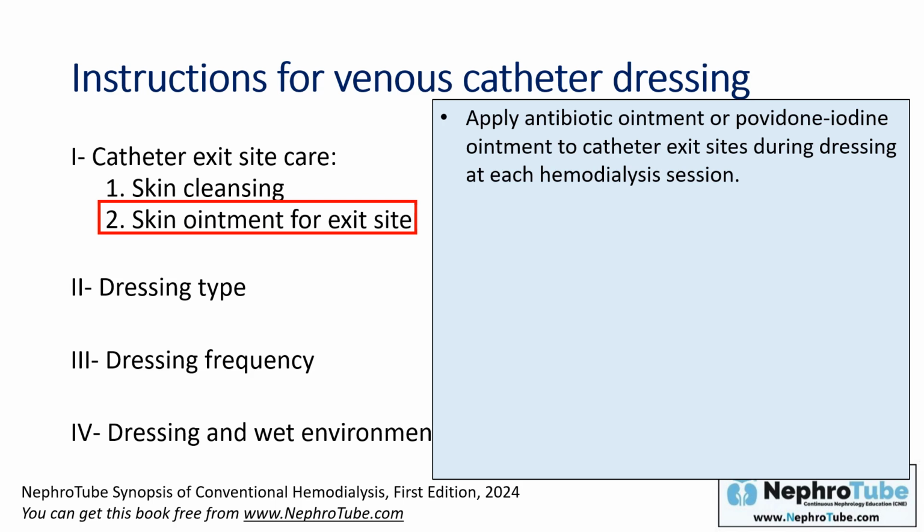I mentioned in my book on page 167 that there is inadequate evidence to demonstrate a difference between these different ointments, except that with a single antibiotic ointment containing mupirocin, the development of resistance may be high.